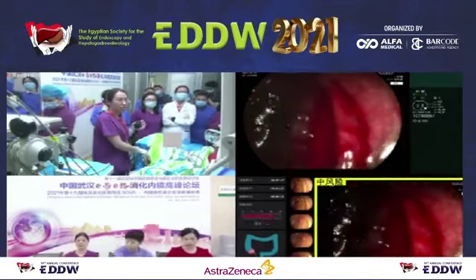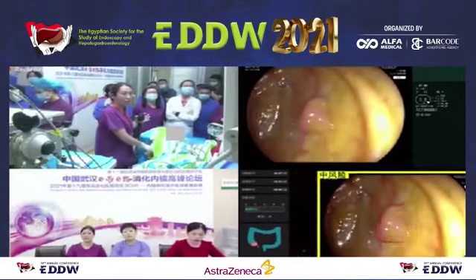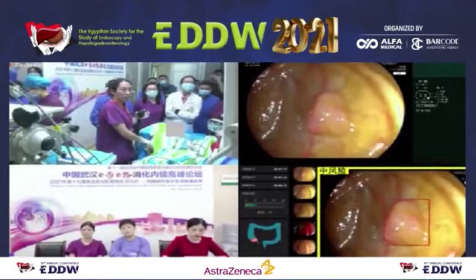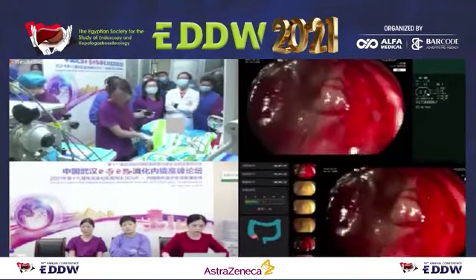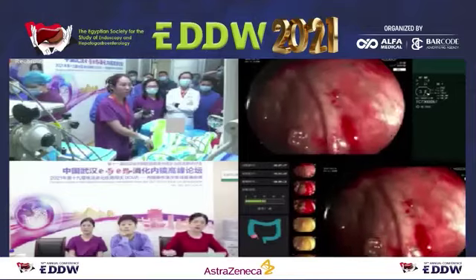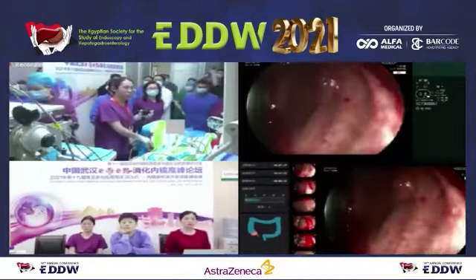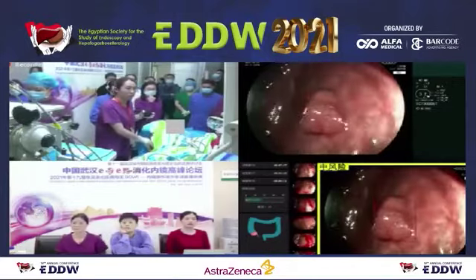From this moment, I will change the light. If you can see the LCI, this is the LCI. And I'll change it into the BLI.